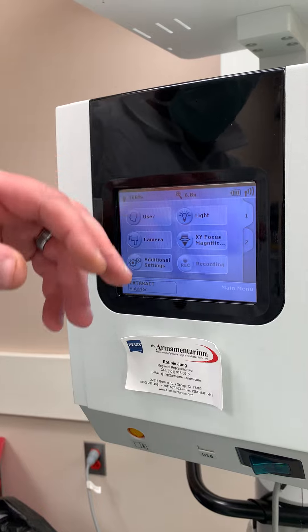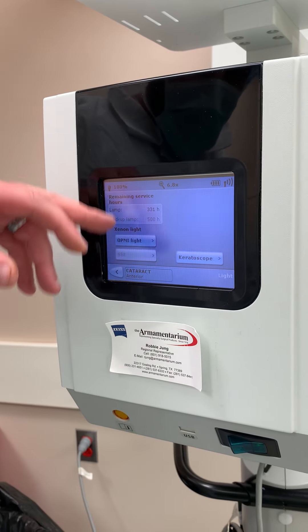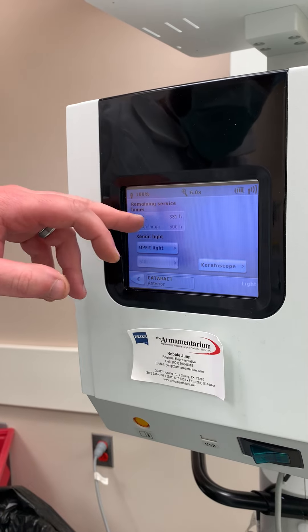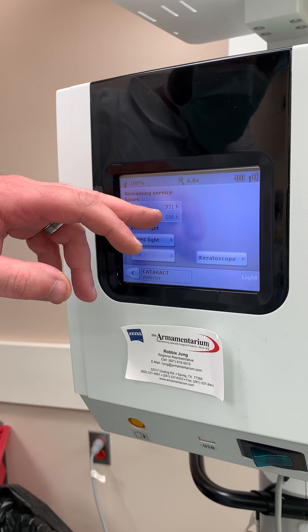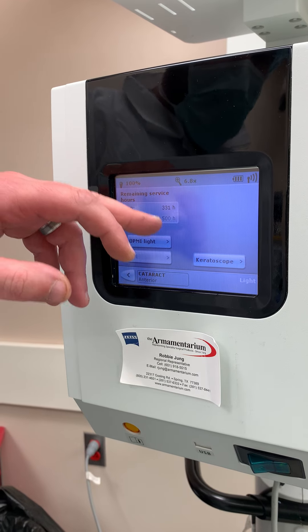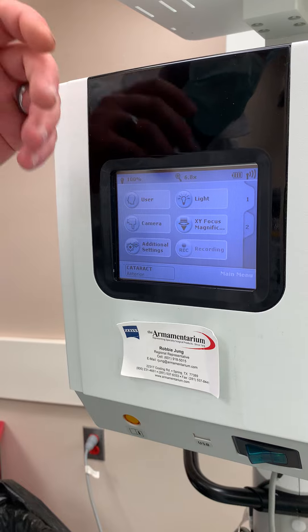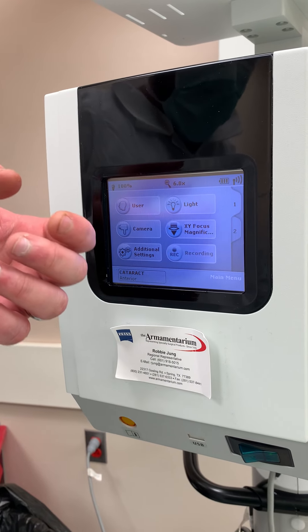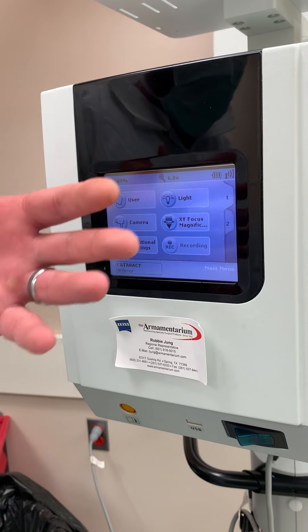One of the big errors that you do not want to ignore is if the light is getting low. If you hit Light, you'll see how many hours you have left. Lamp one has 331 hours remaining; the backup lamp has 500. The problem with these Xenon light bulbs is that they don't dim down when they start losing life, and eventually they'll just blow up.